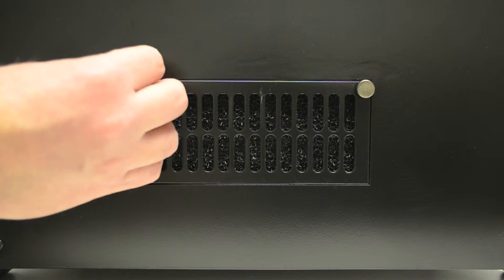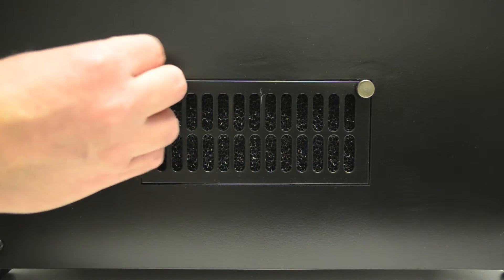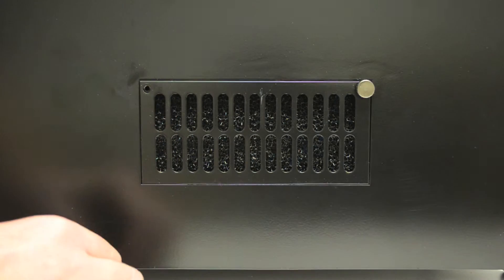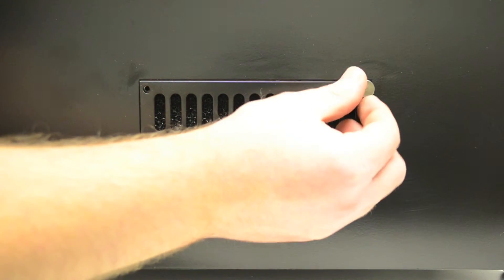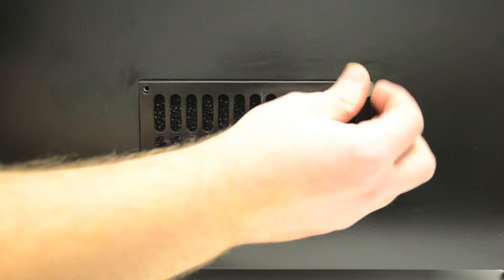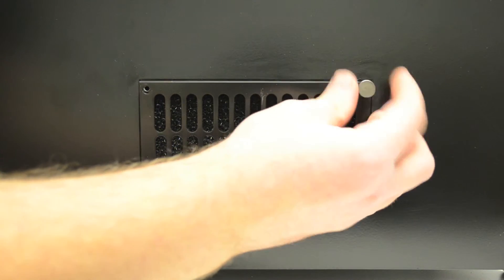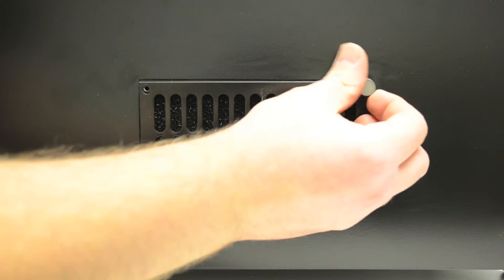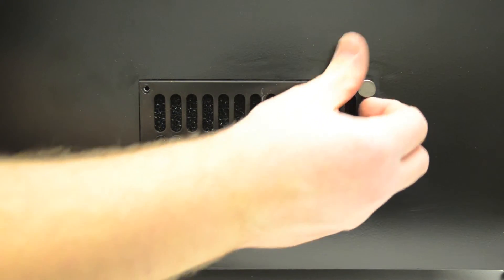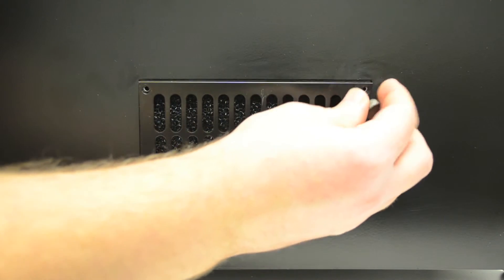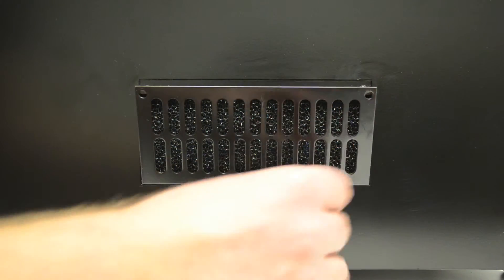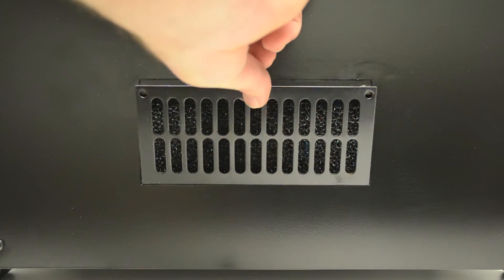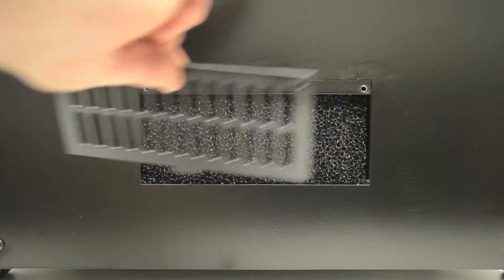Two thumb screws hold the cover in place. Remove the thumb screws and remove the cover.